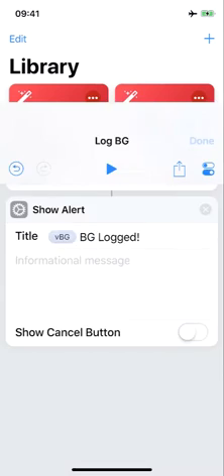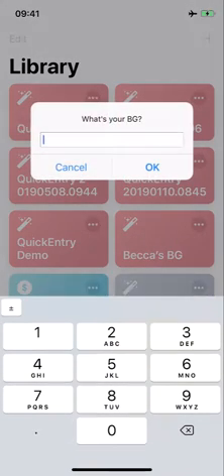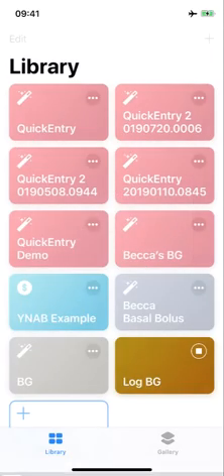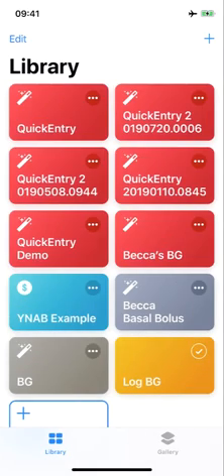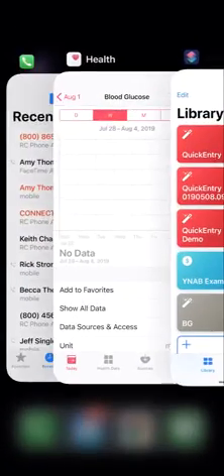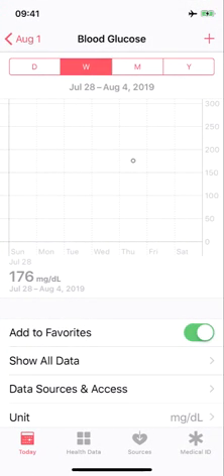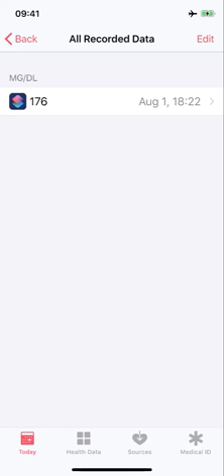So if I hit done, you can see my yellow icon there on the bottom, log BG. So I'll go ahead and touch that. What's your BG? I'll do 176. Okay, 176 BG logged. And touch OK. Now if I go back to Apple Health, you'll see there's my 176. Show all data. 176.